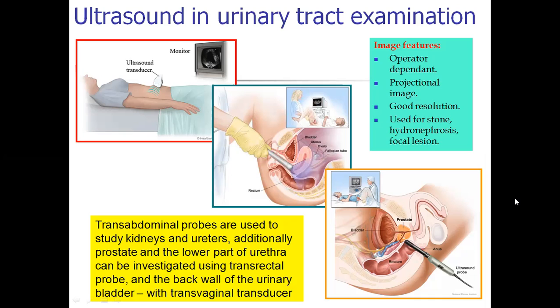Ultrasound examination is an operator-dependent method of study. It means that if you undergo an ultrasound exam, please try to do it on the same machine and with the same operator, with the same doctor.